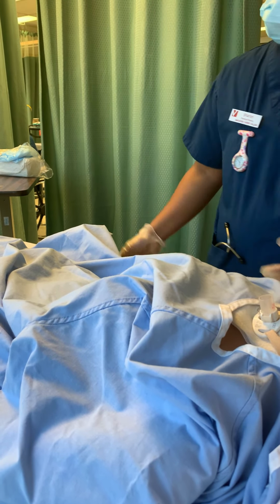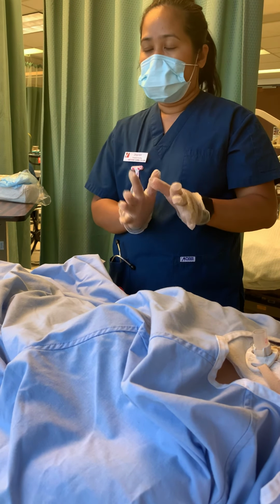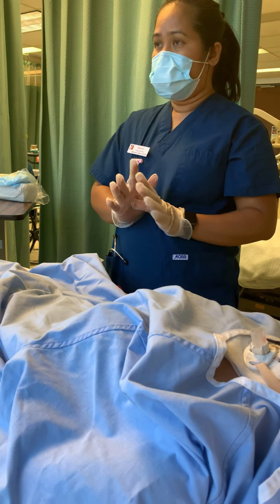Also check for bladder distension, check for any pain and skin integrity. You can do the bladder scanner to see how much pee. So I found out that he had 800 cc of urine, so we have to do a catheter on him. Explain to the patient all the time, even if they don't understand you, even if they're not cognitive at all. It's how you show respect and dignity to the patient.